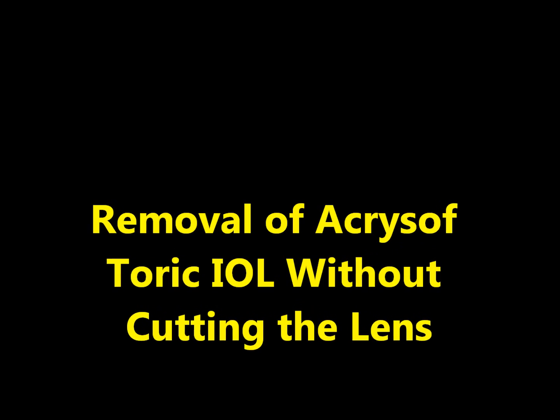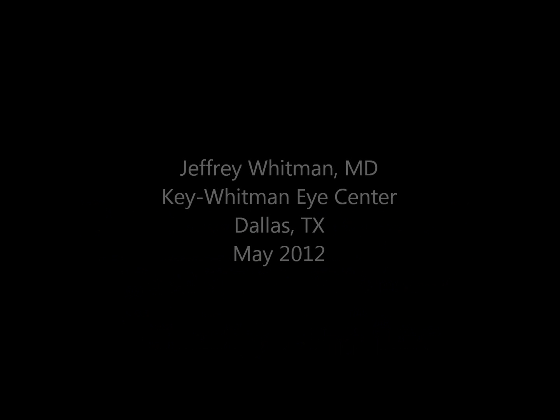This is Dr. Jeffrey Whitman describing the removal of an AcrySof Toric lens without cutting the lens for removal.